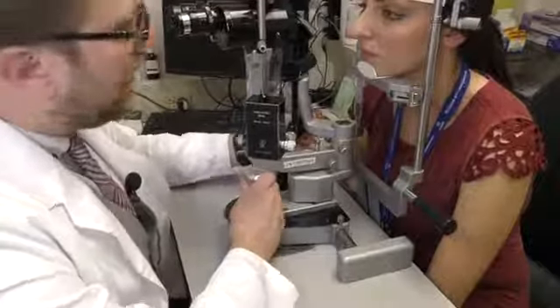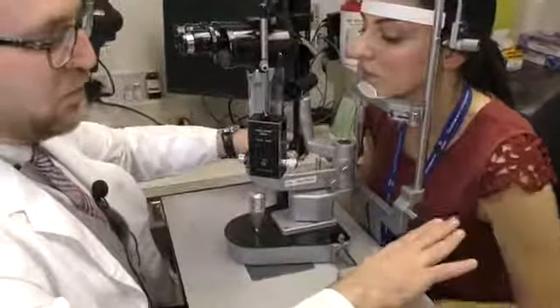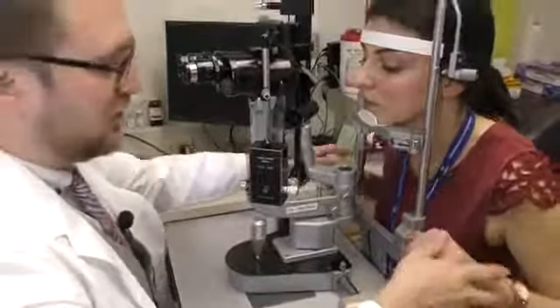What I also like to have the patient do before I start is hold the armrest here. That way they can hold themselves up in the machine. This is very useful, especially for your elderly patients who have neck stiffness or cervical issues and difficulty staying up in the machine. This way they can help stay in a good position. So next, what we want to do is examine the eye.